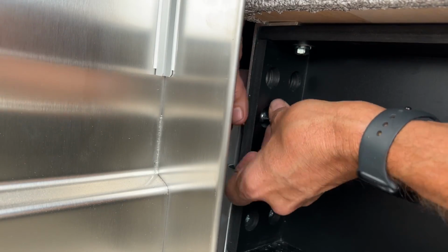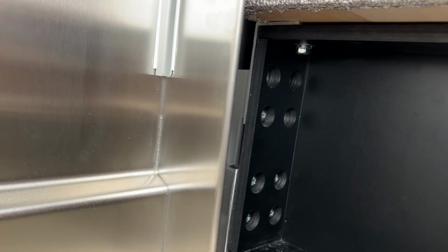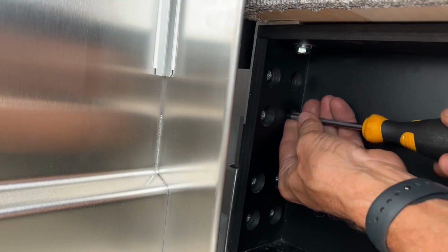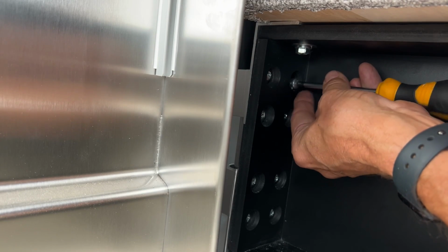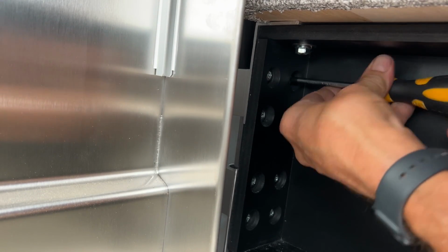Now repeat this with the upper bearing, and on the upper bearing you want to find that first hole, put the first screw in, and then once you do that, all the other ones should line up pretty easily. Get them started and just put them in relatively loose. Now after you have gotten the last screw in, go ahead and tighten up all the screws to a strong tight. I must repeat this. Now that all screws are in, you need to tighten each and every one of them to a good strong hand tight with your screwdriver.